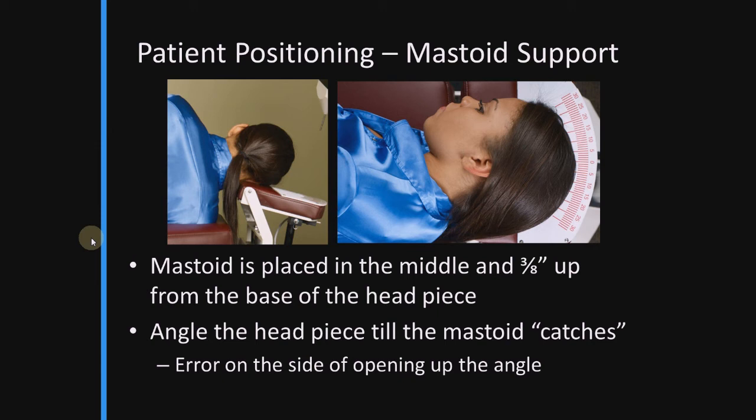We're going to angle the headpiece till the mastoid catches, which is essentially matching the shape of the mastoid. If you were going to err, you would rather err on opening up the headpiece angle a little too much rather than not enough.